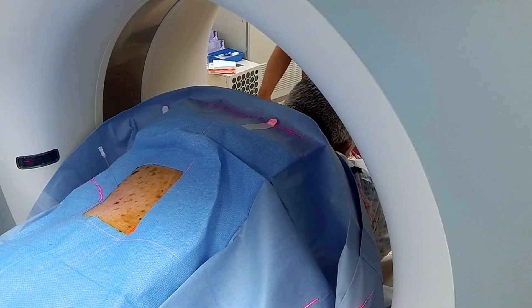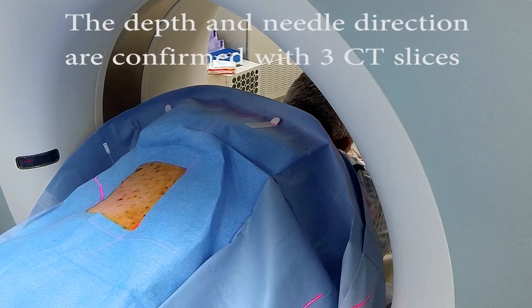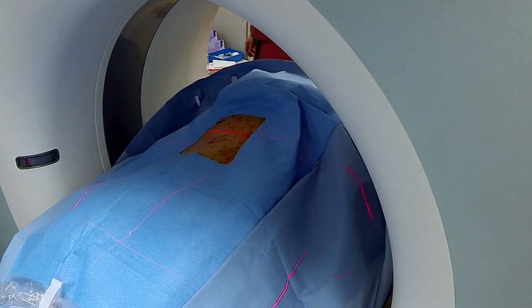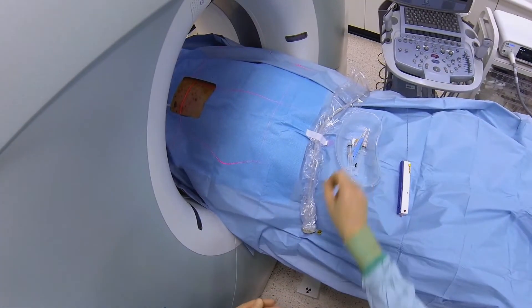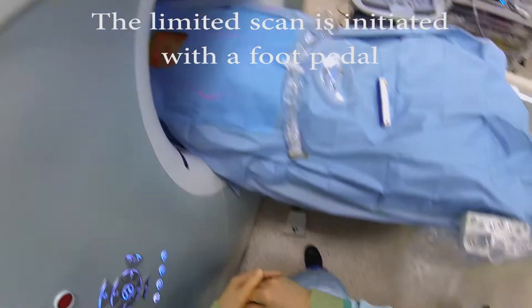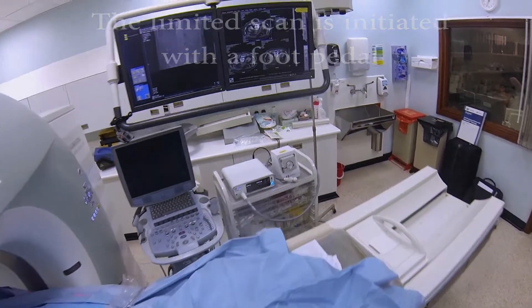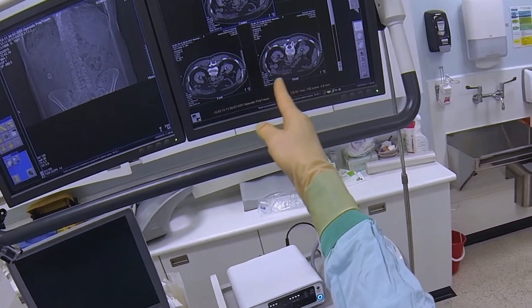Now we're just going to do a scan there. Breathe in for me now, breathe out, stop breathing. Breathe away — so at the right level, we just need to be aiming slightly more lateral.